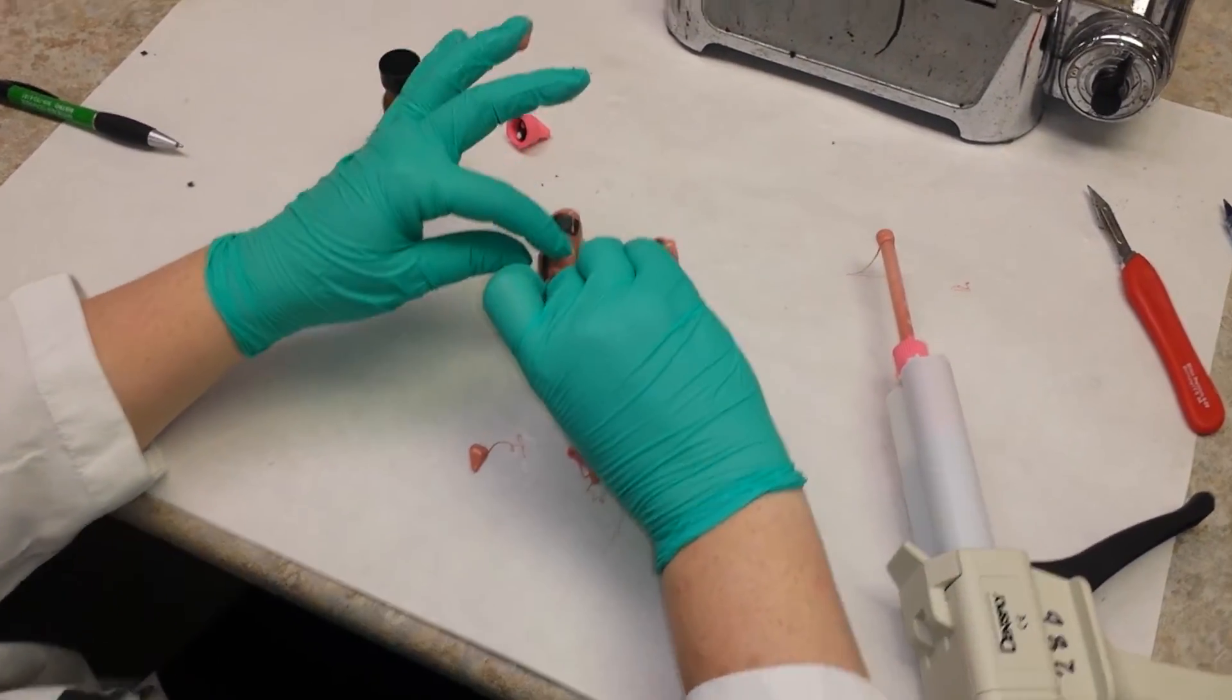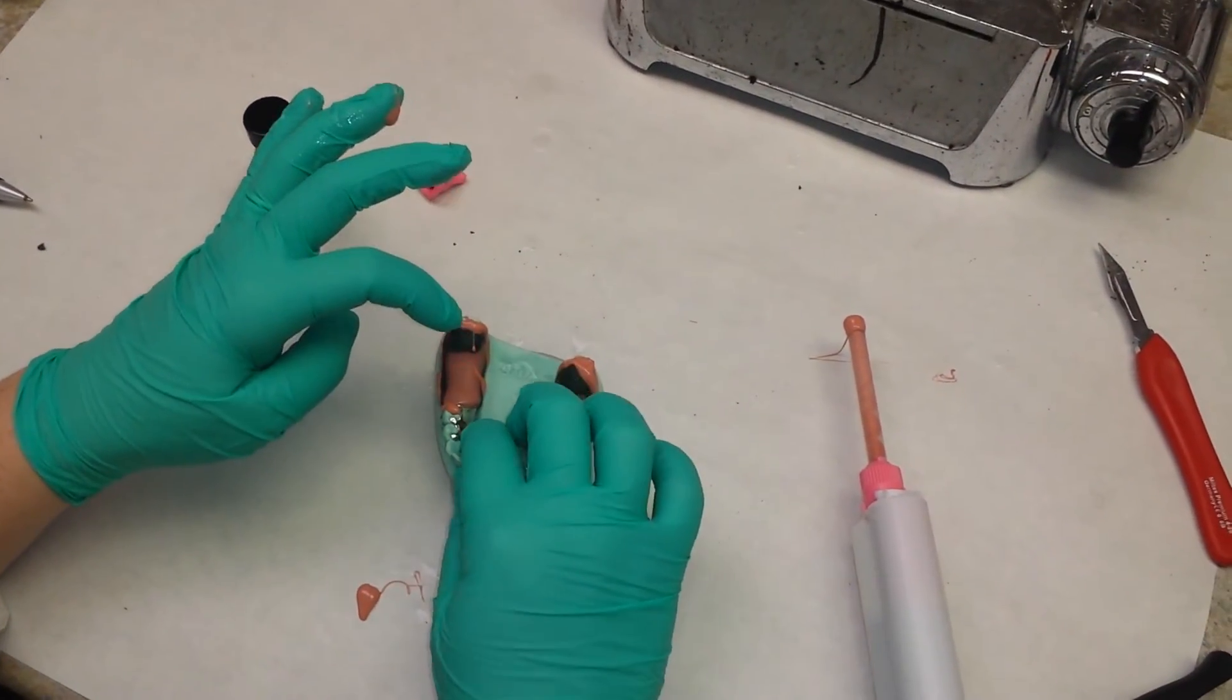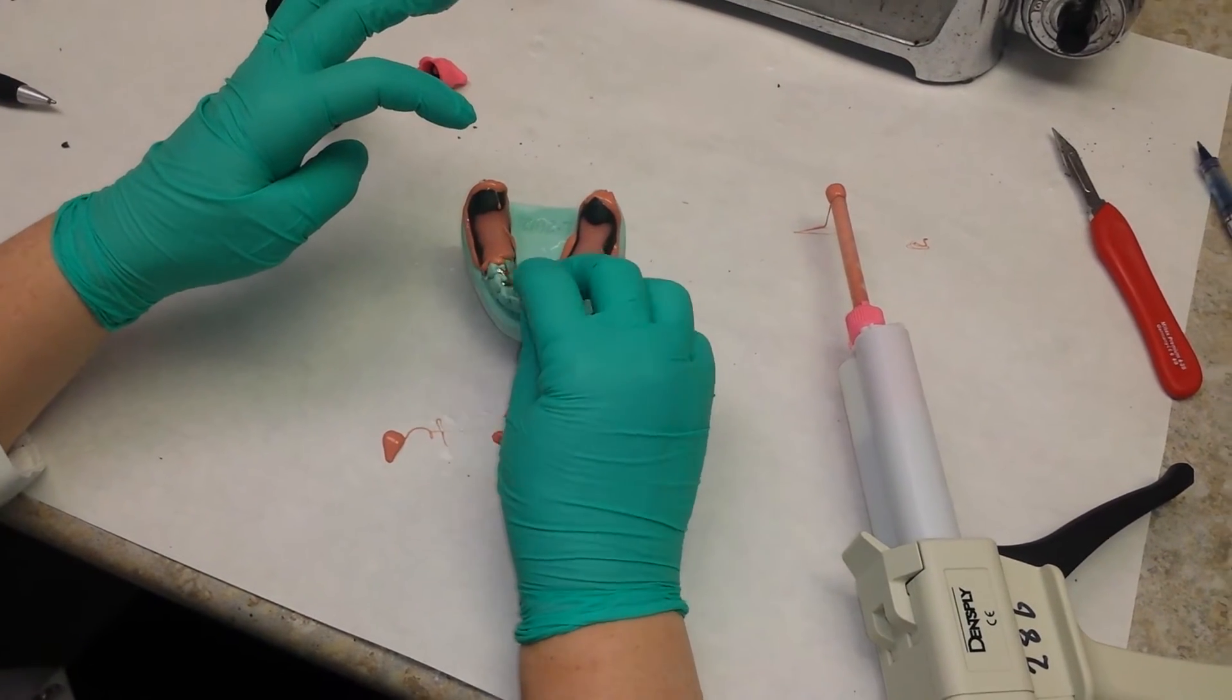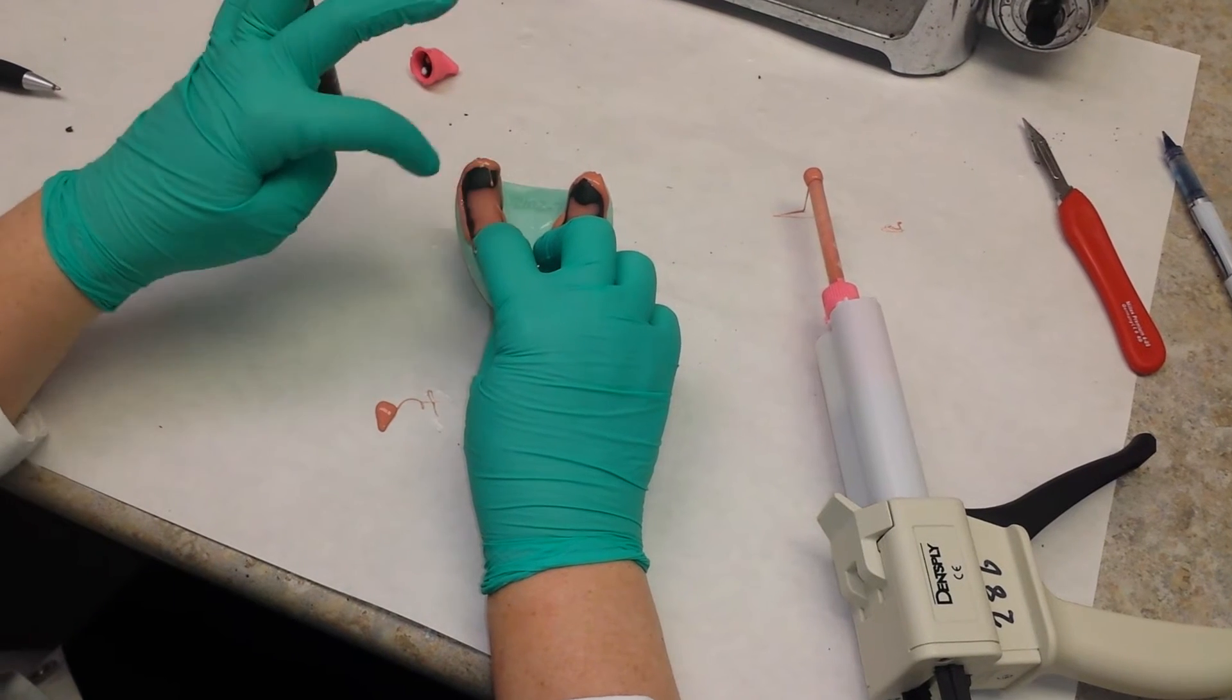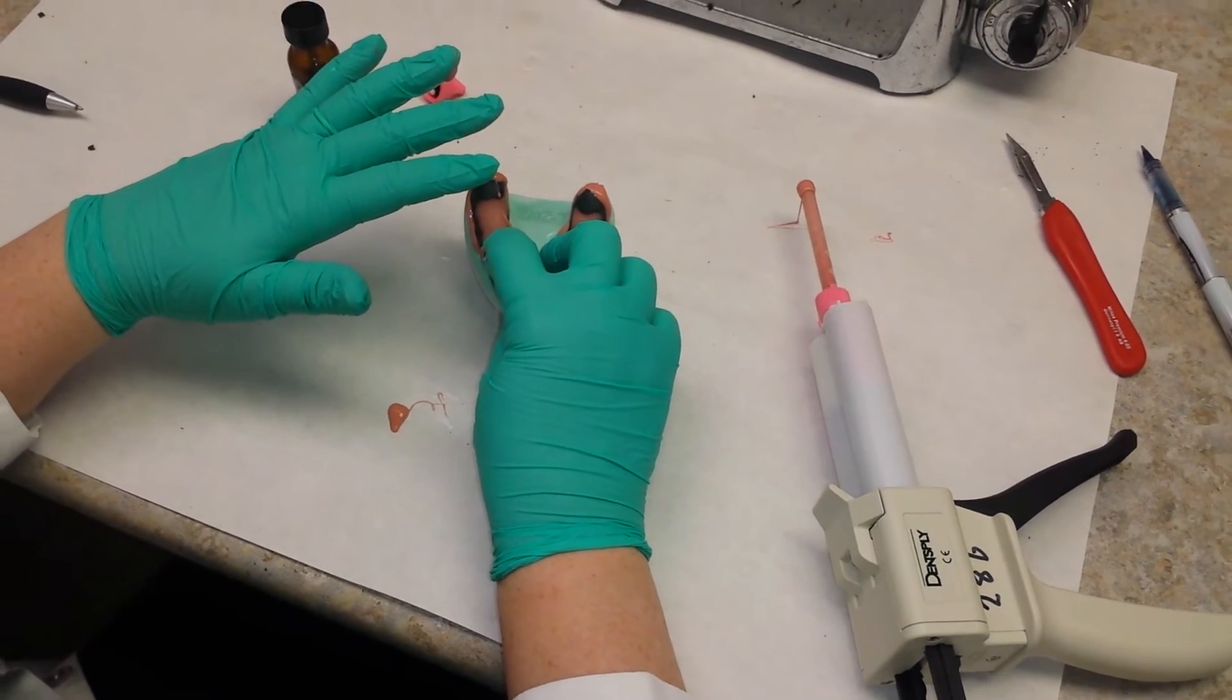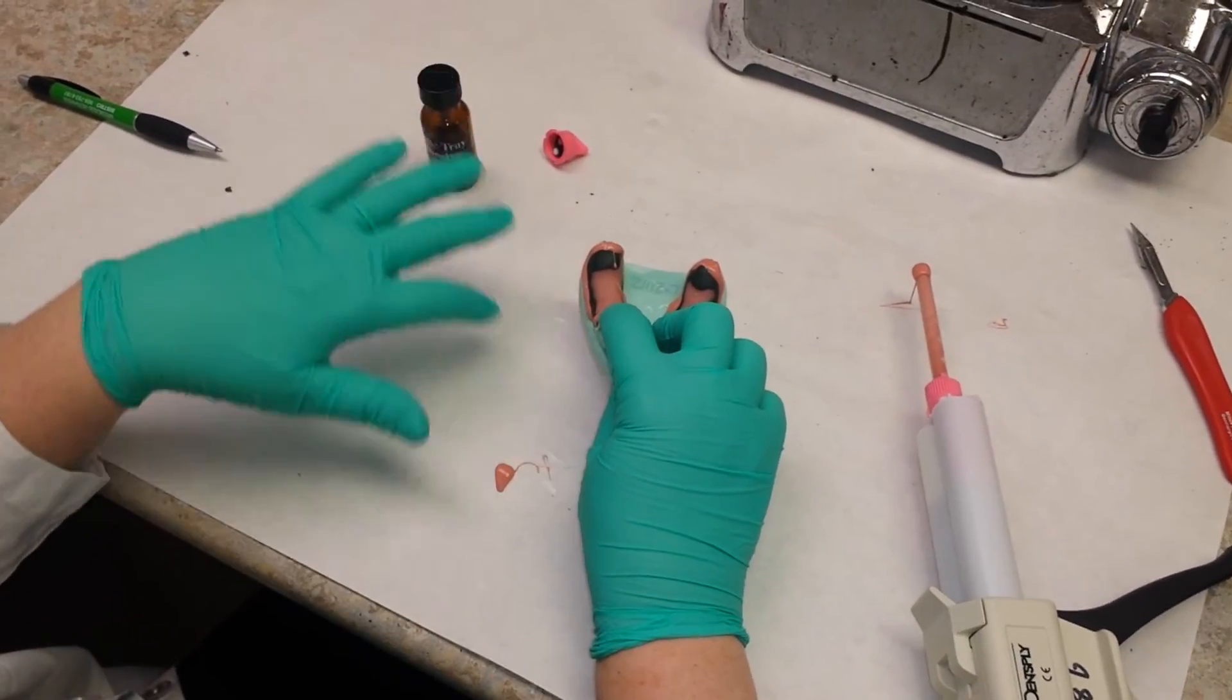We're going to place that in a patient's mouth. When we place it in a patient, we want to press just in the front and we're going to hold all of the rest seats in position and allow the back area to just kind of float where you like it to be, wherever it ends up.